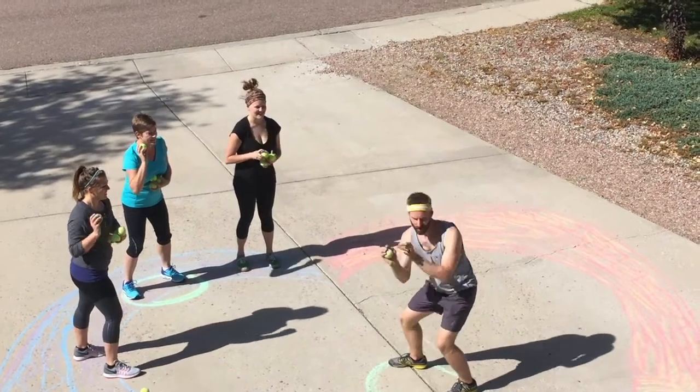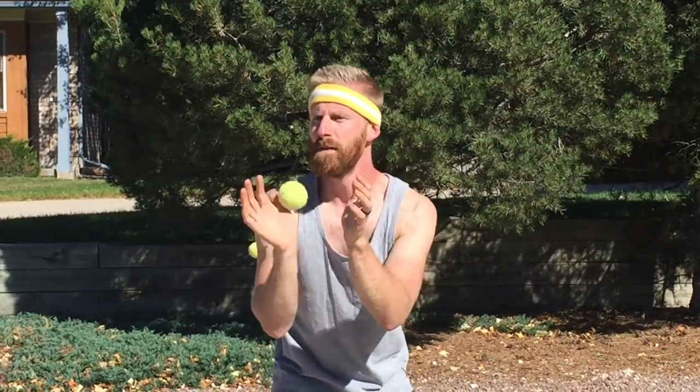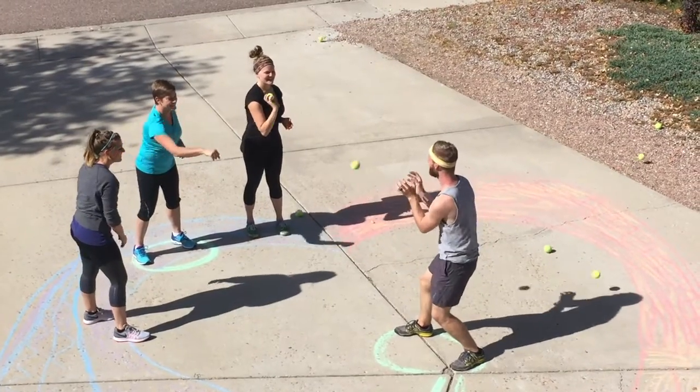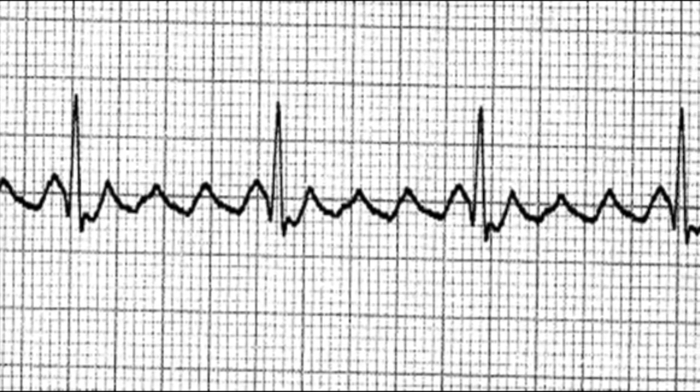A flutter. So you've got those multiple ectopic points and they're passing electricity to the AV node, but the AV node's only taking the ball from one of them. So you have miss, miss, conduct. When the AV node conducts that electricity, that's when you see a QRS complex down the Purkinje fibers.